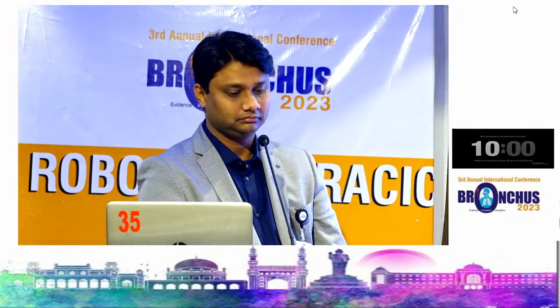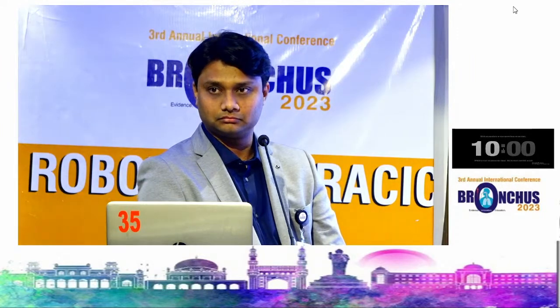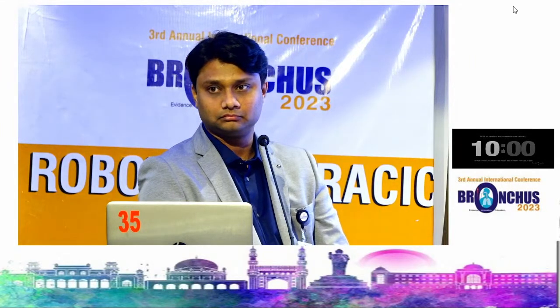In my opinion, there is only a systematic way to approach the hilum or tumor, so that you resect the tumor safely. How many times have we dealt with tumors invading the pulmonary artery anteriorly and the superior vena cava, supposed to be resectable, and we did the opposite? We started dividing the bronchus, then the arteries, and kept the last part, the vein and the superior vena cava, because it's easy to control at the end of the procedure.